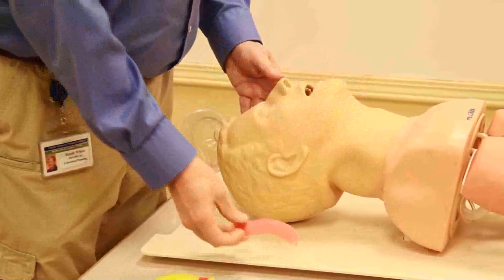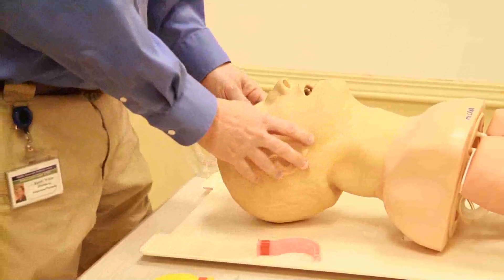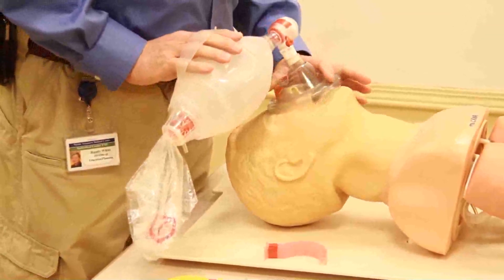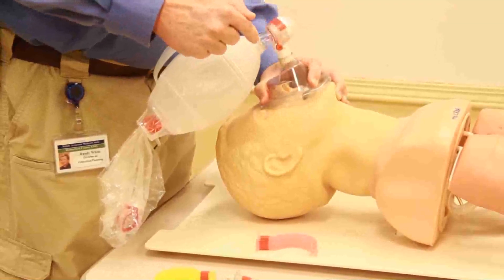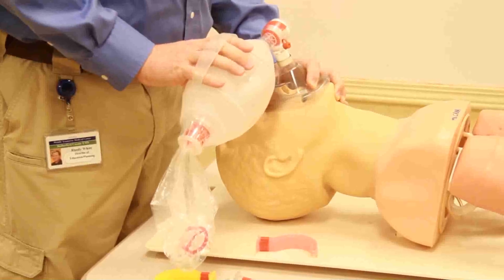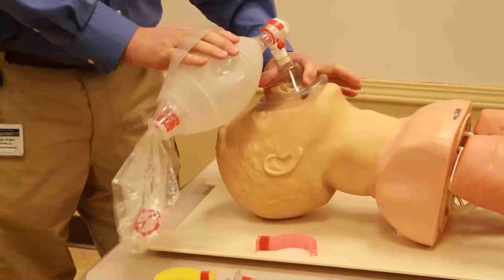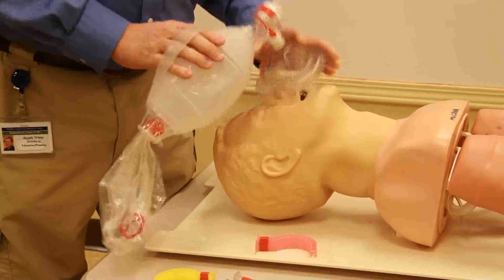Now I'm going to shake and shout, check for a pulse, look, listen and feel — and now my patient is not breathing. If my patient is not breathing but has a pulse, I want to start with the bag valve mask device. I put the bag valve mask over the bridge of the nose and over the mouth, then pull up the chin. I pull up the chin because the tongue is attached to the lower jaw — when I pull up the lower jaw, the tongue comes with it and keeps the airway open. I'll ventilate twice. Note that I'm using a CE technique: grasping the mask with my forefinger and thumb, pulling up on the chin with my other three fingers while pushing the mask down on the patient's face.